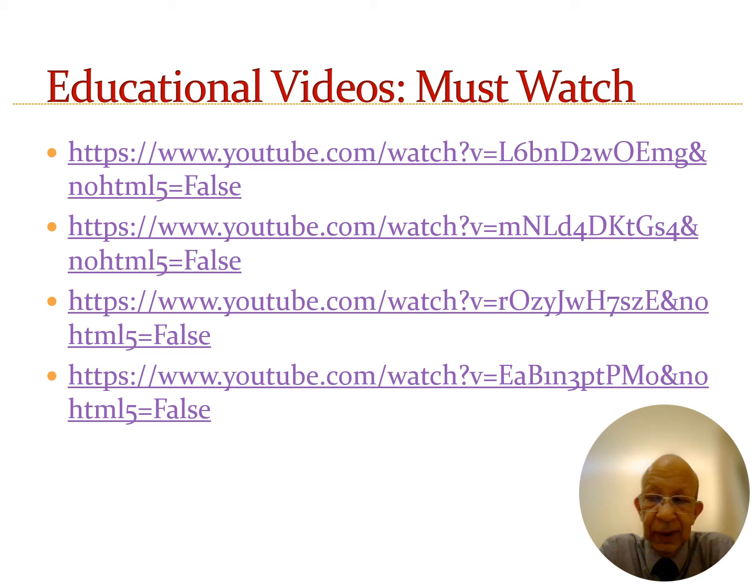What I've tried to do is just take you through some of the tips and rules that govern chest X-ray, and if you are really aware of these, you'll be more confident in reading and interpreting chest X-rays. There are so many videos on YouTube for mastering chest X-ray reading. As I mentioned, my talk is primarily just to give you a good start for becoming an expert in reading and interpreting chest X-rays. So thank you very much for watching, and all the best.